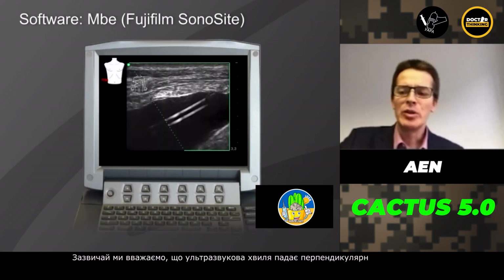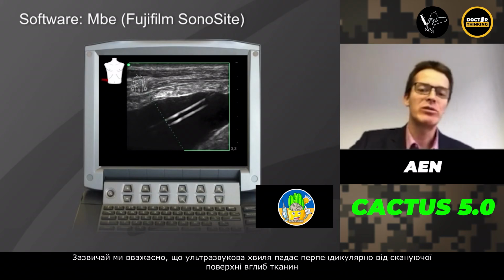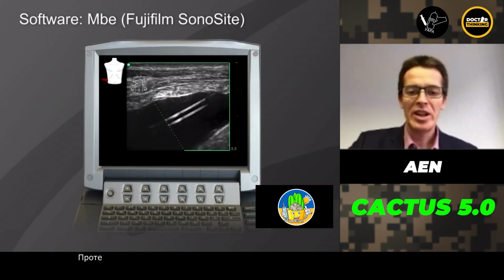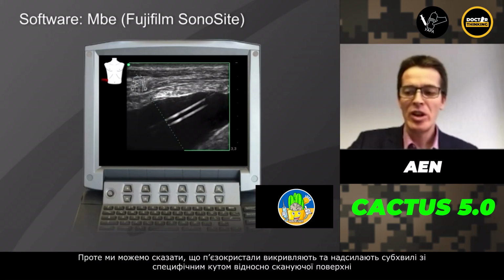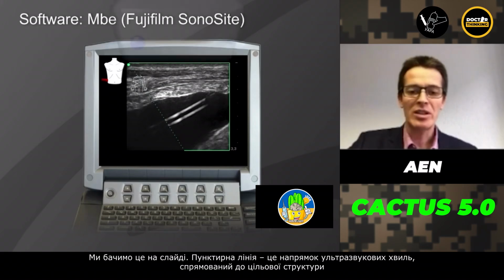Normally we believe that the sound wave travels in a perpendicular direction from the footprint into the tissue, but we can tell the piezo crystals to angulate and to send the sound wave at a specific angle in relation to the footprint, and this is shown here. You see this line with the little points, and this is the direction of the sound waves, which are directed towards a target structure.